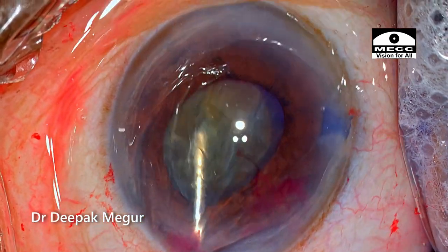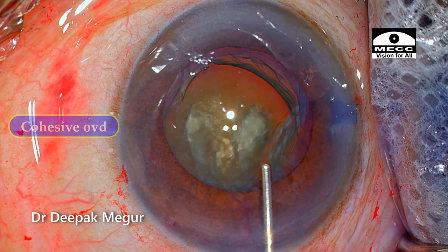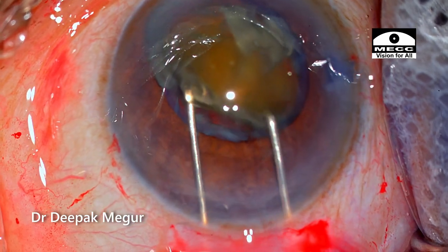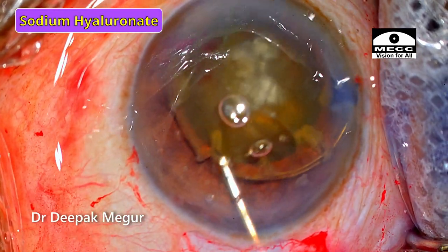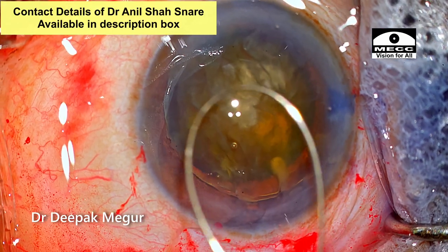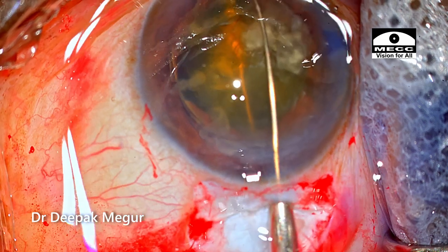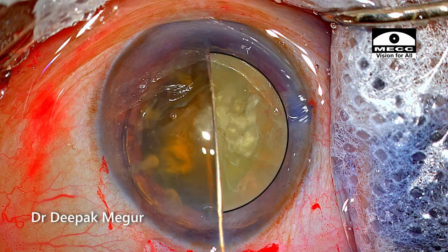Hydrodissection is done and it's ensured that the nucleus is freely mobile. I'm using cohesive OVD containing sodium hyaluronate to maintain the chamber as I'm prolapsing the nucleus out. Then using two Sinsky hooks, the nucleus is wheeled out of the bag into the anterior chamber. The chamber is refilled once again with sodium hyaluronate to create and maintain space as I introduce the snare. I've reduced the diameter of the loop as it enters the eye in a slightly oblique fashion, and once it goes under the nucleus the loop diameter is increased so that it hooks the entire nucleus. I'm now positioning the snare at exactly the center of the nucleus to get equal-sized hemi-nuclei.